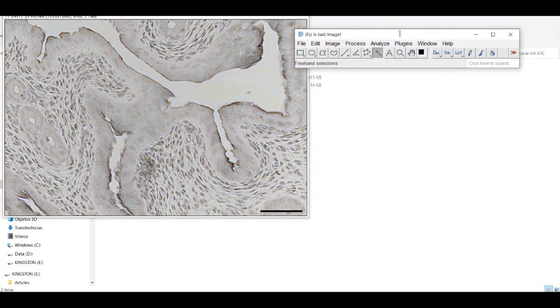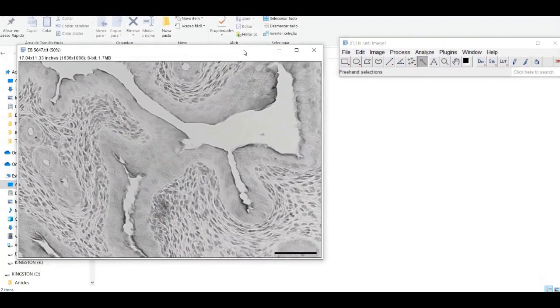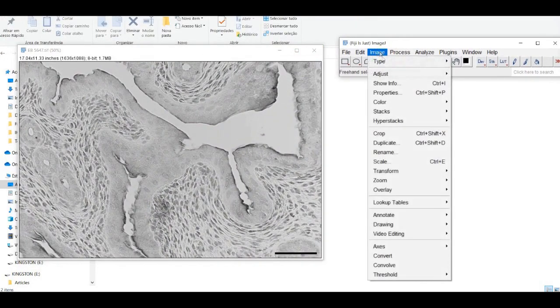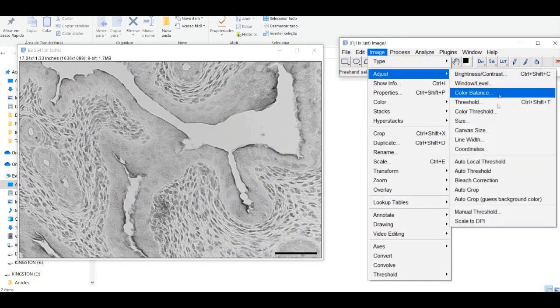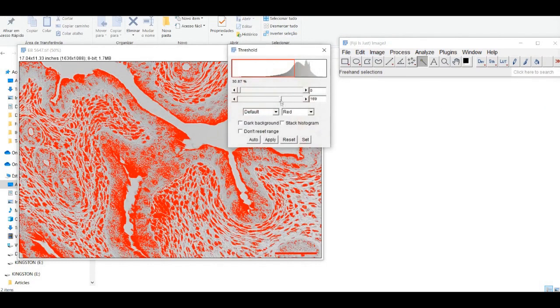You can do this by selecting the Threshold command from the Image menu and adjusting the threshold levels to segment the regions of interest.